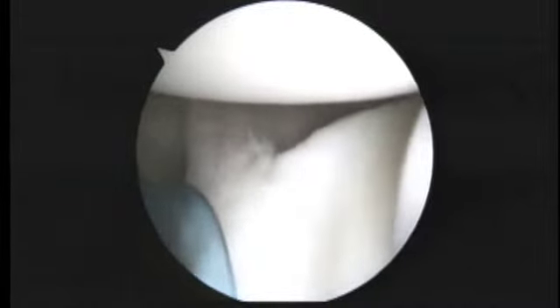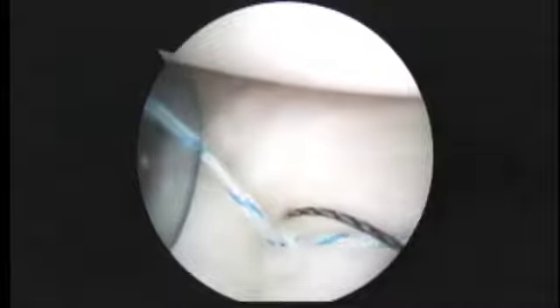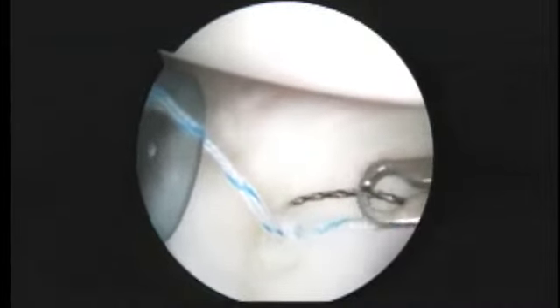Come on over here with the drill. We'll show you some more in just a minute. Pause, please. Anchor down. We're going to take one suture out to the back. We'll take a turn to the right hook. First stitch right about here. Looks good there. This is going to be what we call a figure 8 stitch. We'll show you some more in a little bit. Pause, please.